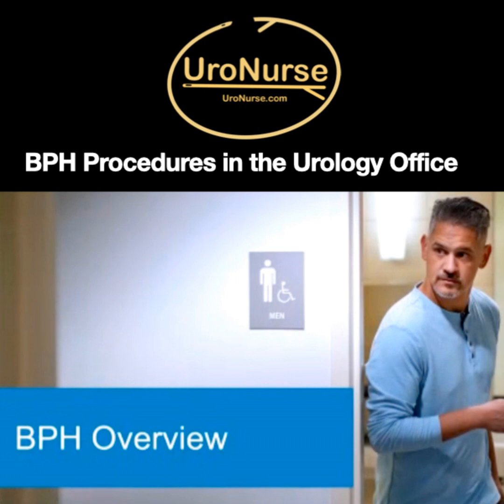Yeah, that's a good point. I have a different spin on it. I do a lot of ultrasonography of the prostate. So we've had enough patients now where I've seen patients that have had Rezum done years ago. I've had patients that have had TURP, green light laser, and the Urolift. And when you look ultrasonically at a TURP, the so-called gold standard, or green light, you can see this big open defect. And at least visually, it looks great.